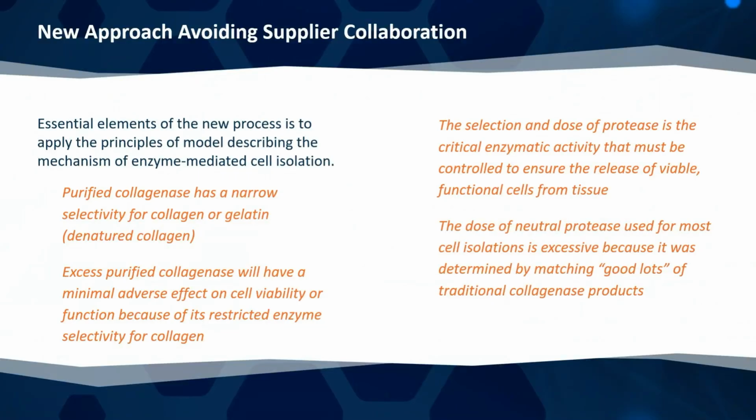You have to realize purified collagenase has really narrow selectivity for collagen and gelatin. It doesn't damage cells. Excess purified collagenase probably has a minimal effect on cell viability. Of course, you can refine it as we've done in the prior experiment I shared with you, but in general, it shouldn't cause a lot of problems.